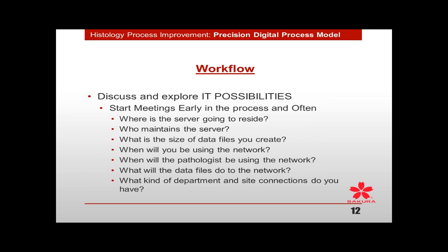It sounds simple that we're going to buy a scanner, but now you've got to save all these images, and where's that storage going to come from? Who's going to pay for that storage? Where's that storage going to be? How's it going to be backed up? What's the size of the data files you're going to create? Is it going to be by cases? Is it going to be by individual images? A lot more detail has to be understood.